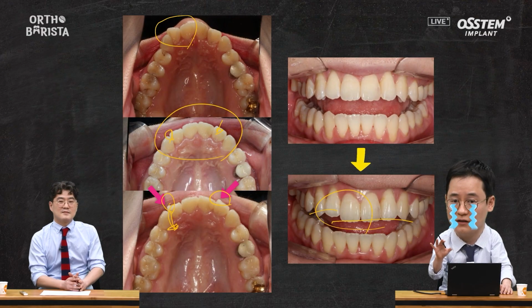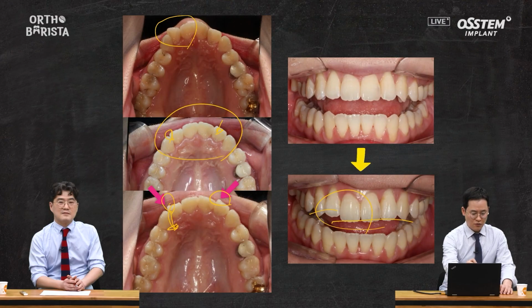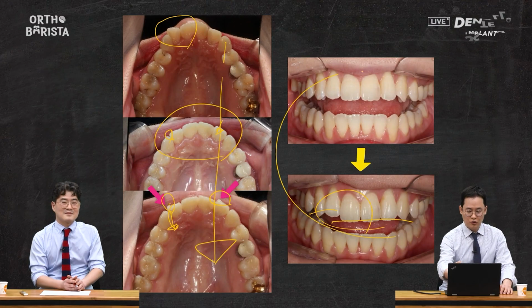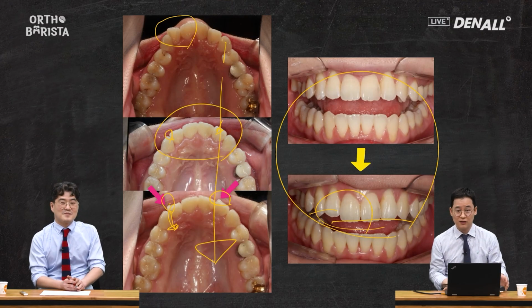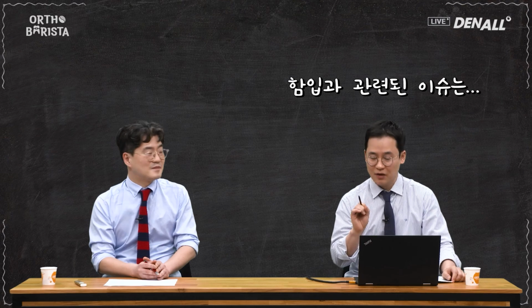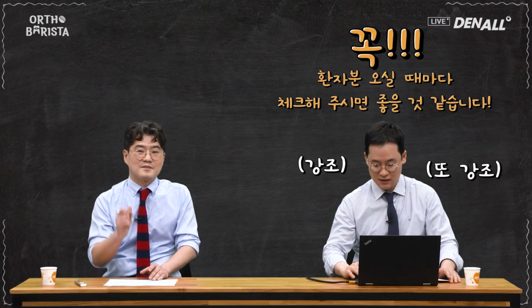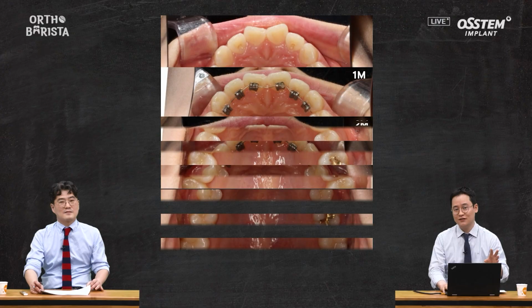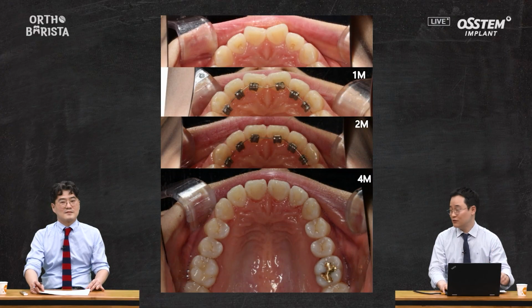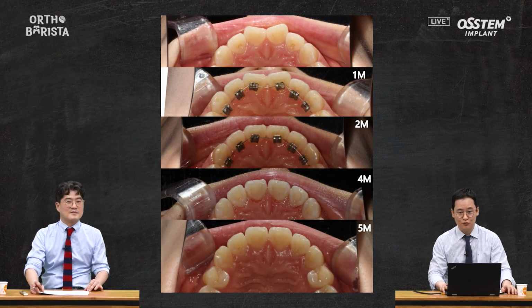Such issues are surprisingly common in clinical practice. After making significant progress, encountering such complications within a short period makes correction more challenging. In such cases, we sometimes temporarily attach partial fixed appliances to address the problem. Therefore, it's crucial to consistently monitor for intrusion-related issues during each patient visit. Depending on the situation, I often collaborate with partial orthodontic appliances. In other words, I sometimes combine clear aligners with partial orthodontic treatment to achieve the desired results.